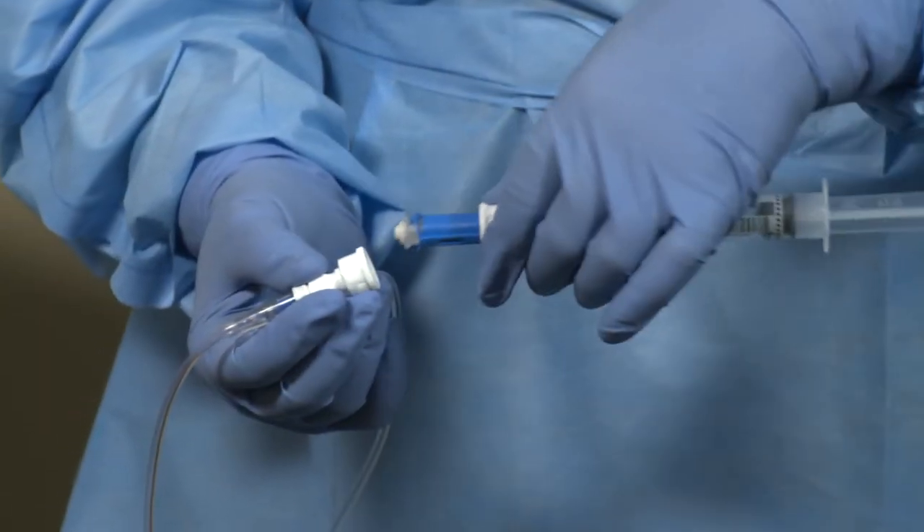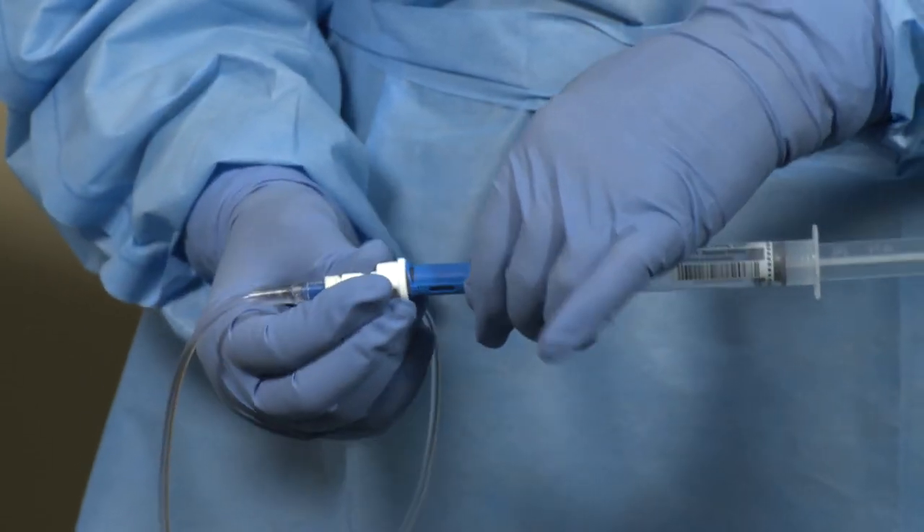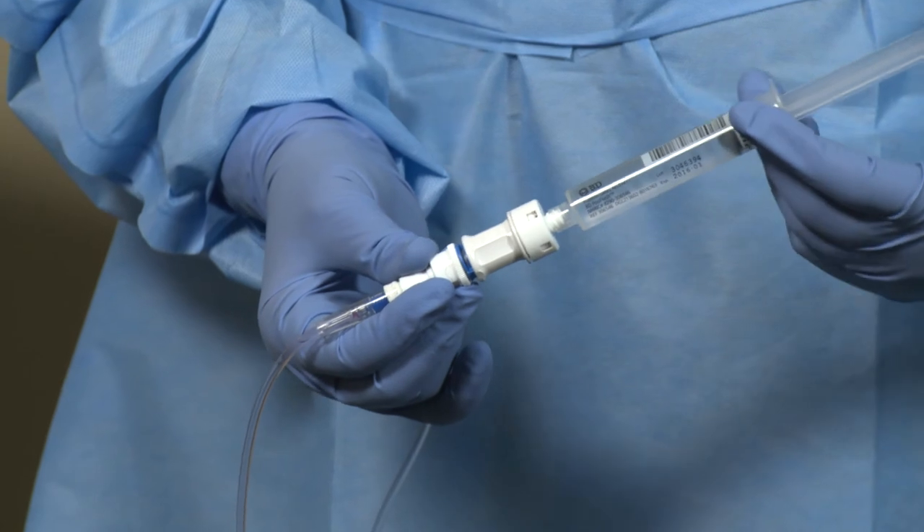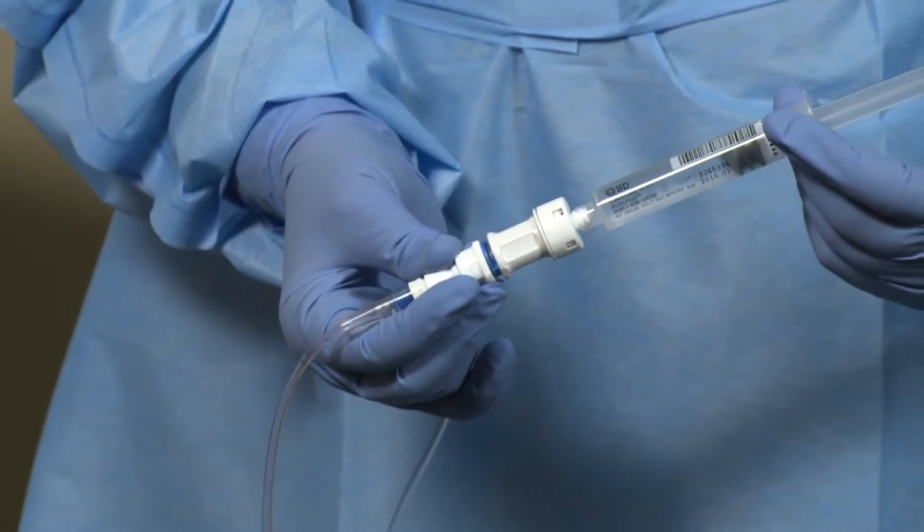Engage the syringe unit to the BDFASIL connector on the IV line using the push-turn-push technique. Then flush according to your facility's protocol.